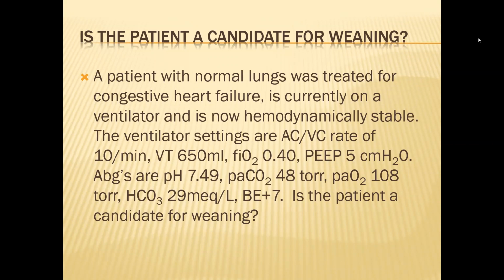Okay, moving right along. Is the patient a candidate for weaning? The scenario says a patient with normal lungs was treated for congestive heart failure, is currently on a ventilator, and is now hemodynamically stable. What is the treatment for congestive heart failure?